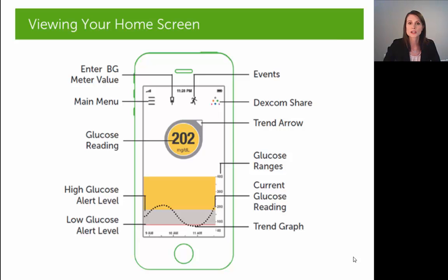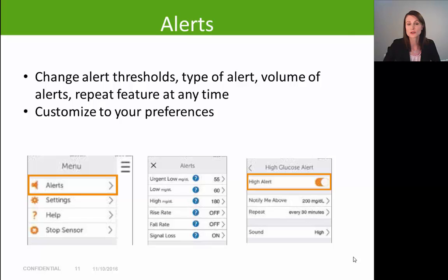In the upper right-hand corner of the home screen you have a Dexcom Share symbol shown as a little triangle, which we'll be reviewing in a moment. To change alerts on your G5 app at any time, select the main menu icon in the upper left-hand corner, select 'Alerts,' and then select the alert you'd like to modify. There you can turn the alert on and off, change the alert threshold, and change the sound for that alert — so you can really customize alerts to meet your individual needs and preferences.